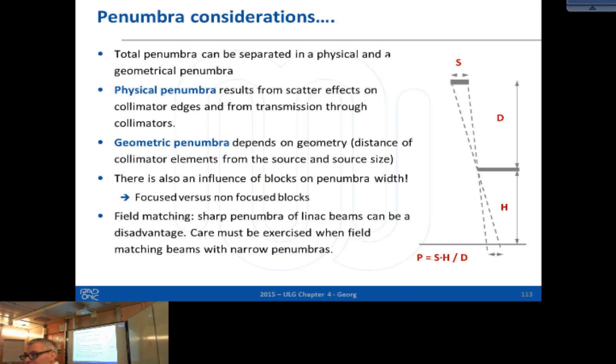So this is also something that needs to be considered. With these events that can happen with radioactive nuclides, our radiation protection authorities were not really happy with these cobalt machines, and they were pretty relaxed when the last cobalt machine disappeared in Austria. And the next thing that needs to be considered is the source replacement. With the diminishing number of cobalt sources, there were fewer and fewer companies who provided source exchange. It was not only the companies that provided these cobalt units, there were other specialized companies.